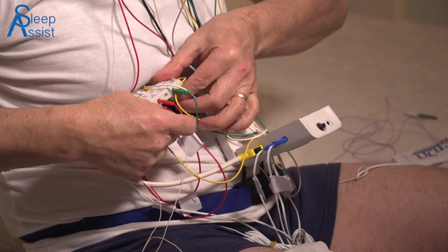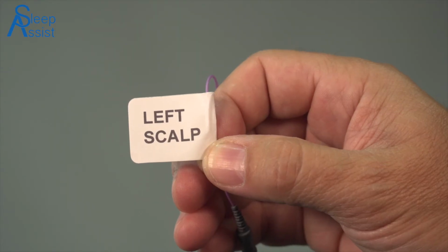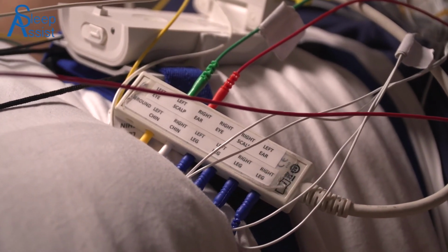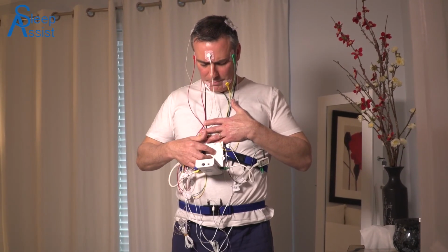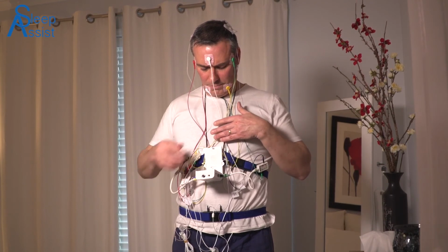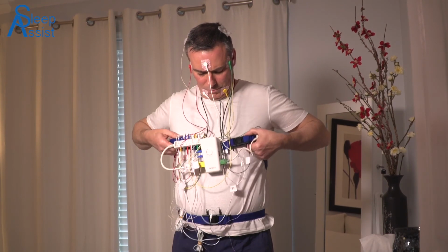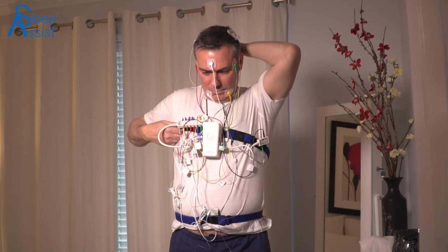Insert the lead marked right scalp into the multi-lead port box labelled right scalp. Insert the lead marked left scalp into the multi-lead port box labelled left scalp. Turn the PDX unit recording device off by pressing and holding the power button down for 5 seconds until the picture of the man has disappeared. Close the PDX unit and reposition the unit above the heart with the blue straps around the chest close to your armpits and tighten the lanyard.